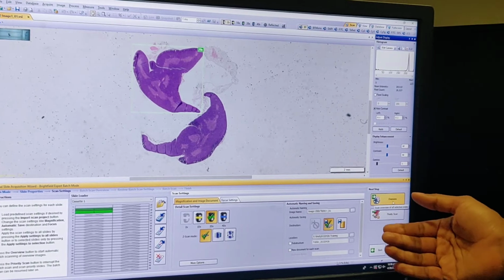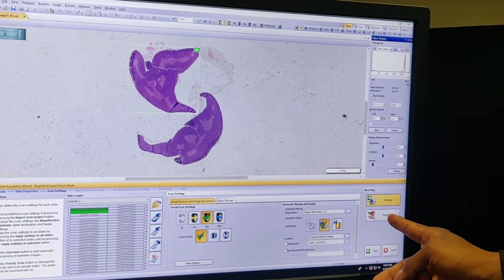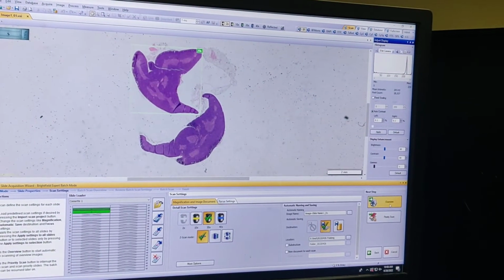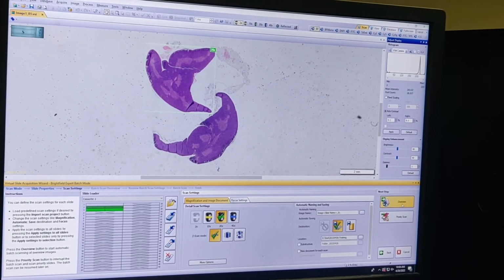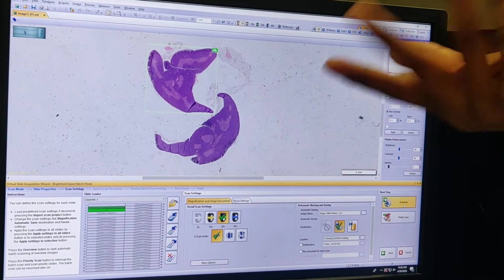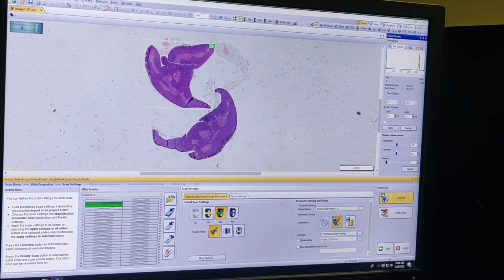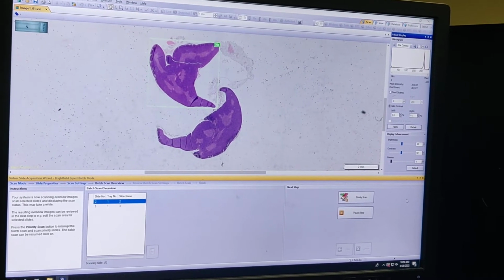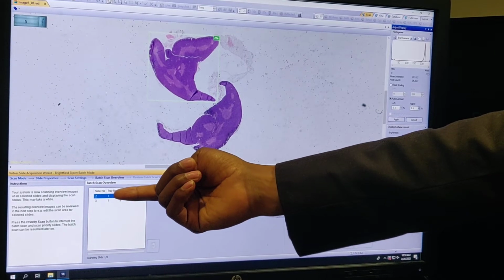Now because it is going in batch mode, there is an option for priority scan, meaning you can pause the batch scan and you can do manual load. So far in the past 4 years, nobody has ever asked me to do that, but there is an option that if you are scanning 50 slides, suddenly you want to image one unique slide, then you can do that without closing everything. Okay? Alright. Now we'll calculate how long it takes for imaging one slide.